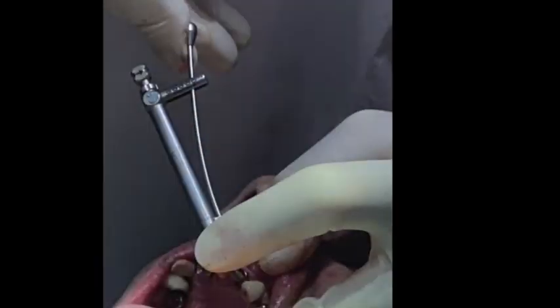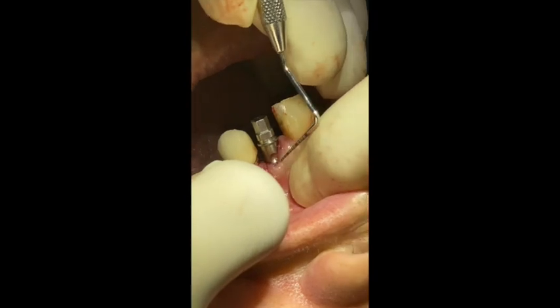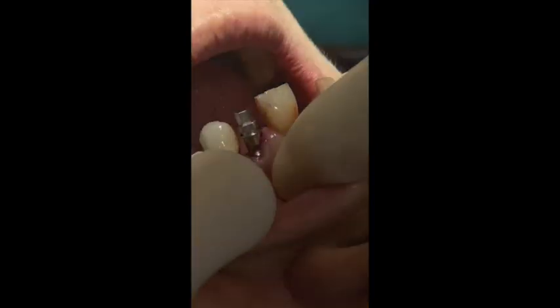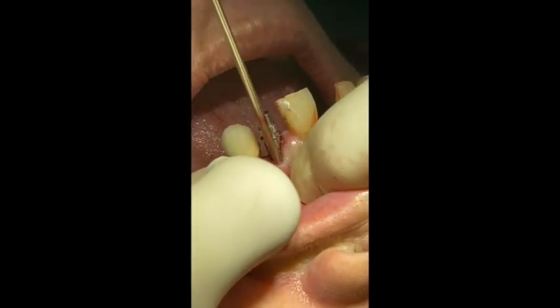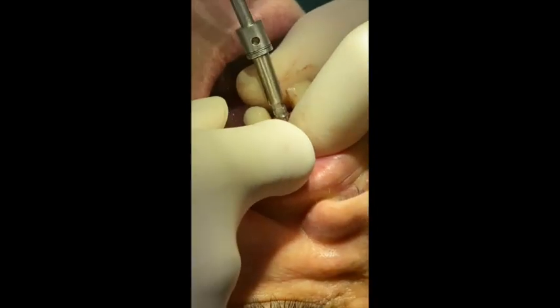100. There's a black line there — you see it? You must not see it. That's 3mm from the platform, so we need to go one full turn.